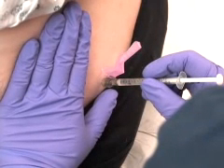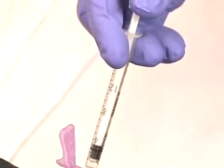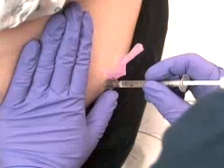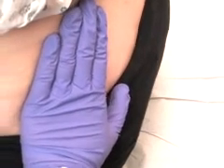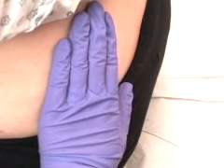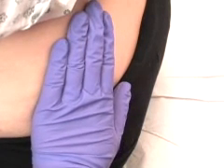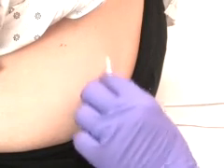Continue holding the skin away from the needle site and inject the medication. Wait for 10 seconds. After 10 seconds, quickly withdraw the needle and allow the skin to track back over the original injection site. This allows the subcutaneous tissue to cover the muscular injection site. Blot the area gently with an alcohol wipe.